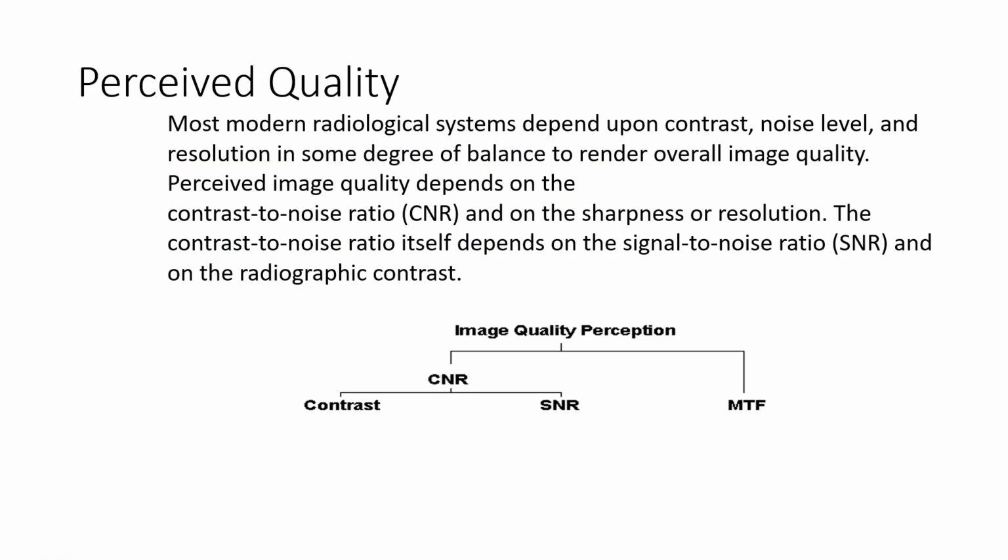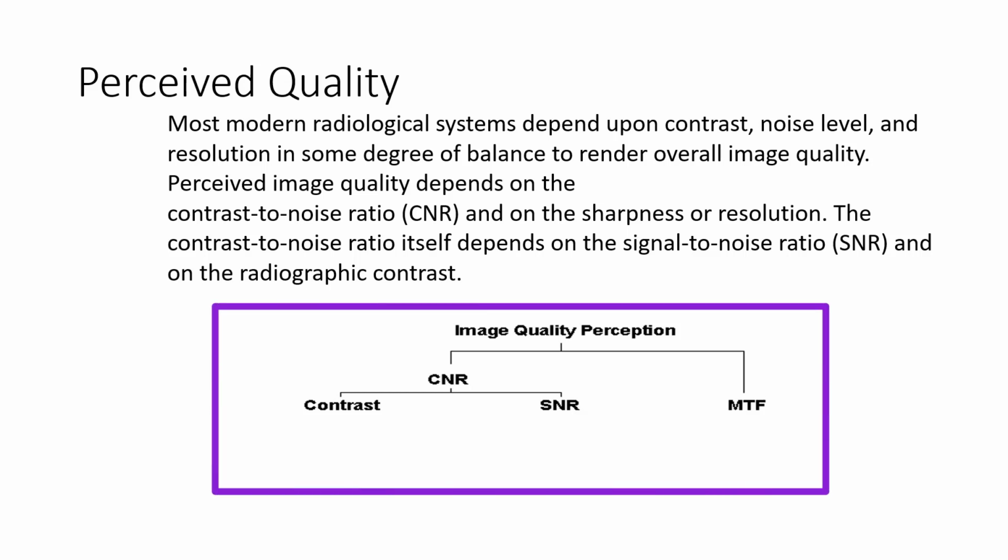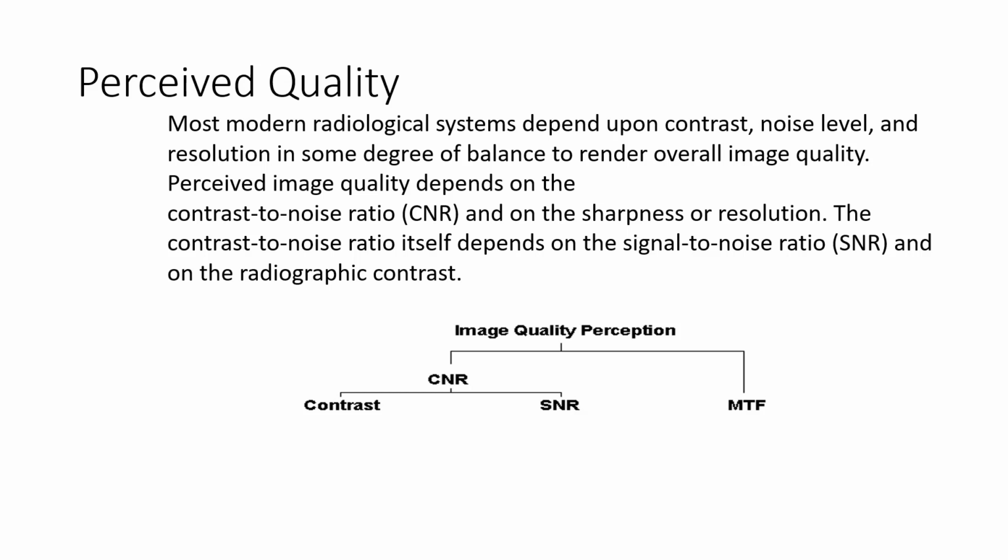Understanding your equipment from the X-ray machine to the image receptor and how the interaction of ionizing radiation occurs with tissue will allow you to get a better idea of how to correct for errors or see where the errors actually happen. It might be in the signal to noise ratio that you're using. If you don't have a strong enough signal, enough radiation, you're going to end up with quantum mottle or a salt and pepper look to your image. If you have too much radiation, you're going to flatten the image. You're going to lose some detail. Remember, image quality is the perception. We're recording an image and we want to look at sharpness and resolution as well as contrast.